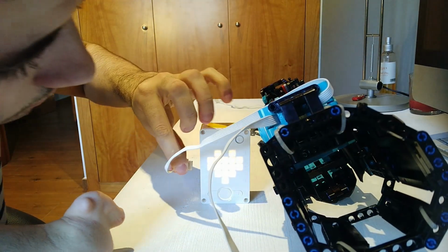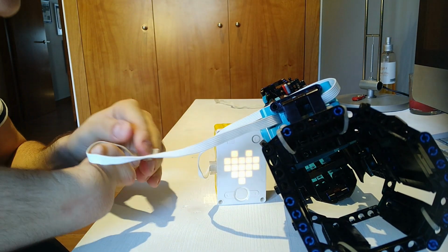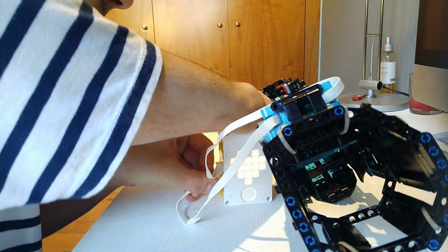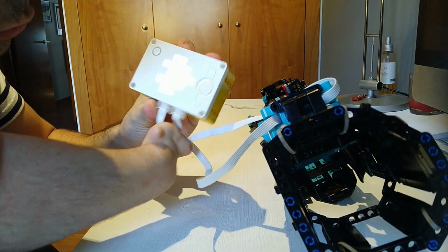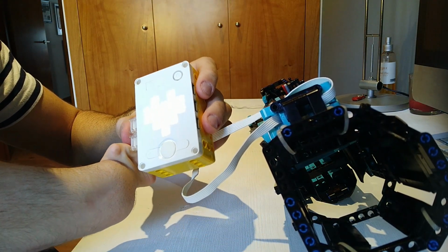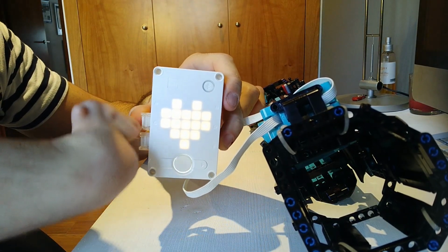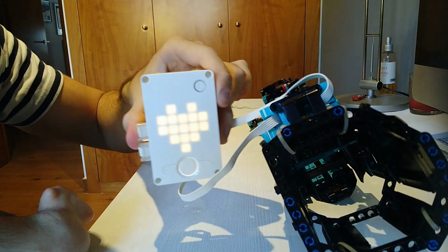It doesn't matter which motor you connect to the hub. The only thing that matters is that you don't put the motors in the other holes. So the program won't work because it doesn't have any orders for the other ports to communicate with the motors. And it should look like this. This is my left side, so C and E, only for those 2 motors.